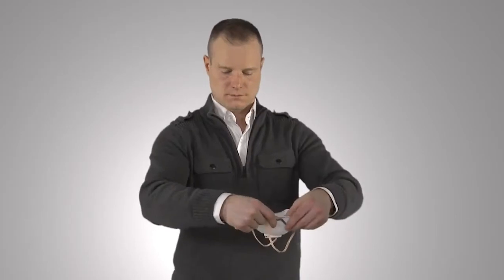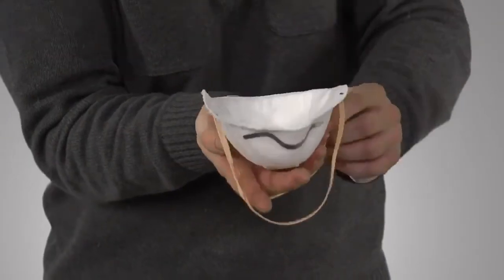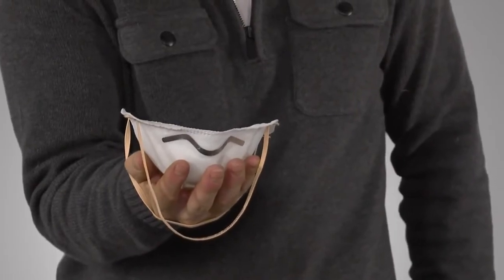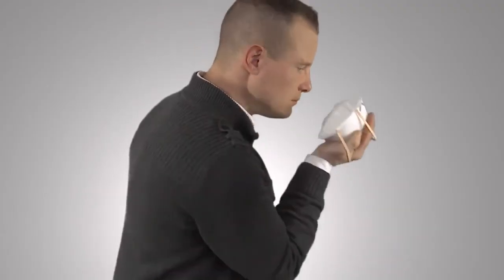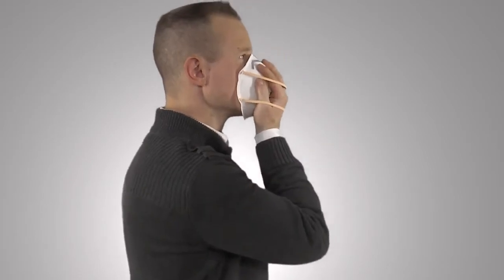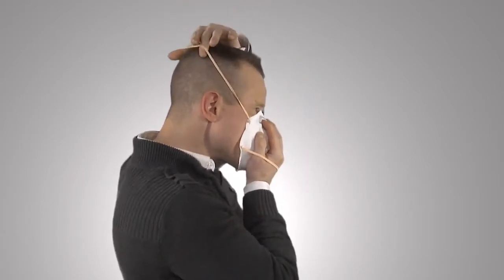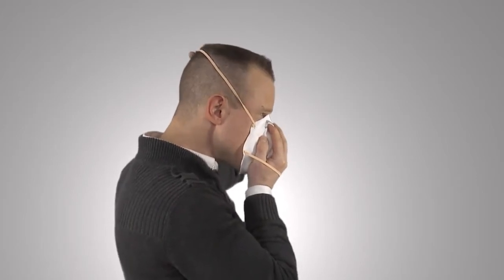To begin use: First, cup the respirator in your hand with the nose piece at your fingertips, allowing the headbands to hang freely below your hand. Second, position the respirator under your chin with the nose piece up.